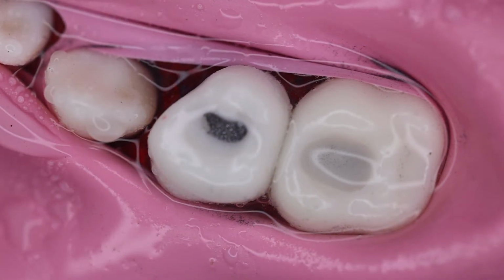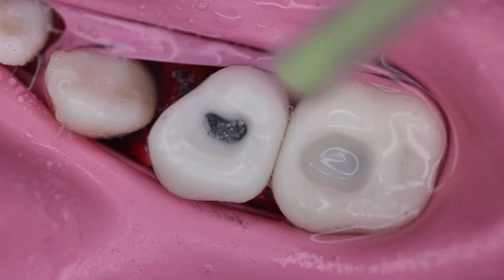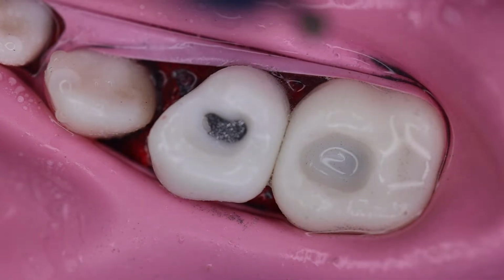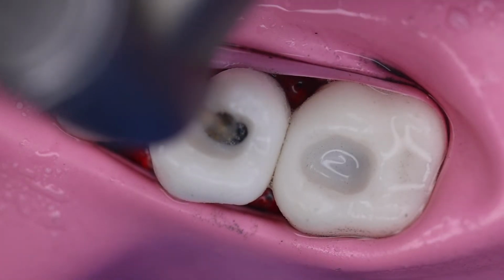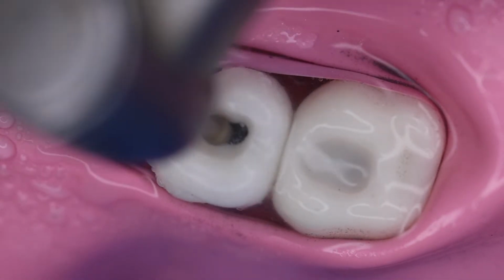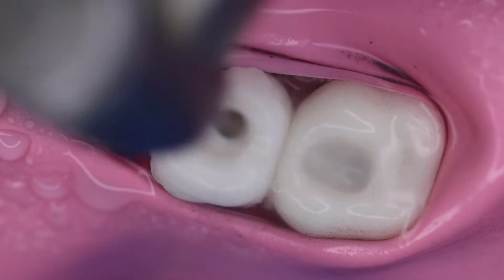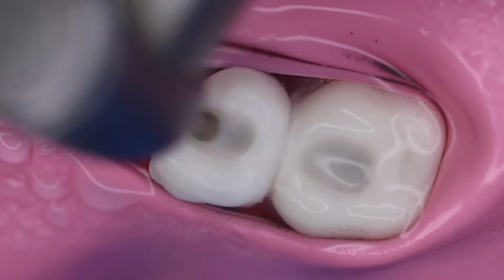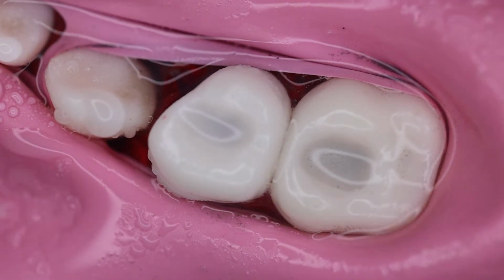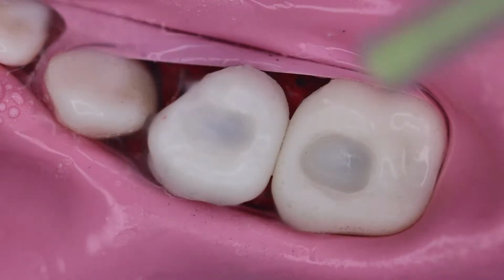Try to conserve the maximum tooth structure, the sound tooth structure. There is an ongoing poll as to what should be the best approach when there are no clinical signs and symptoms. Over here, in the other tooth also, we are able to remove the carious lesion.